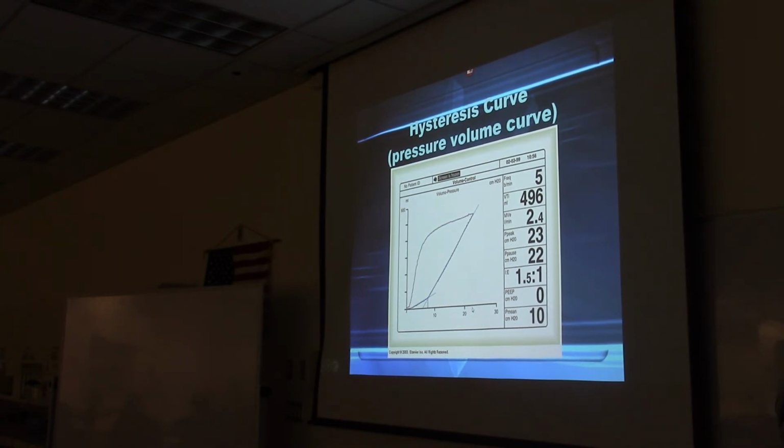Did you peek? All right. And what was the maximum volume that went into the lungs? So you go to the top, and then you come across, and you look to see what the volume is. Yes, about 500 mLs went in. So the x-axis is the peak inspiratory pressure? Yes. And then the y-axis is volume? Yes.